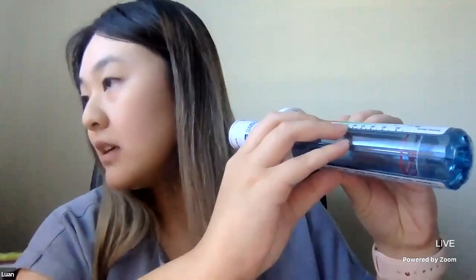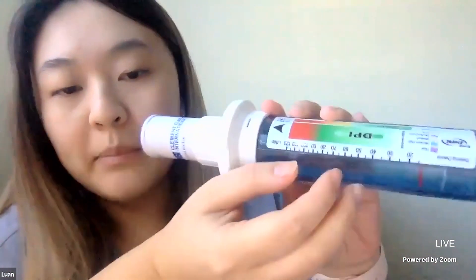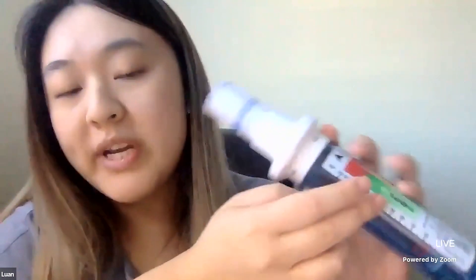To properly use the InCheck dial, make sure the mouthpiece is on top. Tell the patient to hold the InCheck dial like a sandwich with the label facing up toward the ceiling. Make sure the weight with the red wheel is all the way on the bottom — tap it once to confirm. Once in the sandwich position, tell the patient to exhale away from the device and then forcefully inhale through the mouthpiece. The wheel will reflect a number indicating the patient's inspiratory flow rate, which helps clinicians choose the correct inhaler based on flow rate and force of inhalation.